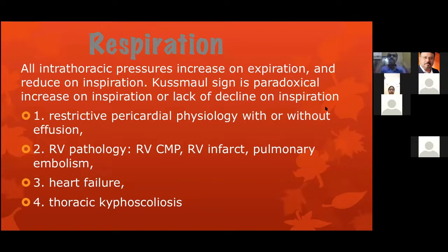So the mean is electronically averaged from the pressures. All the area under the curve is averaged. That is how the mean is calculated. Which catheters are ideal for measuring pressures in different chambers? Practicality dictates the pigtail is the ideal catheter, but the pigtail cannot be put in all the areas. So we have to use sometimes an end hole catheter, sometimes a side hole catheter.